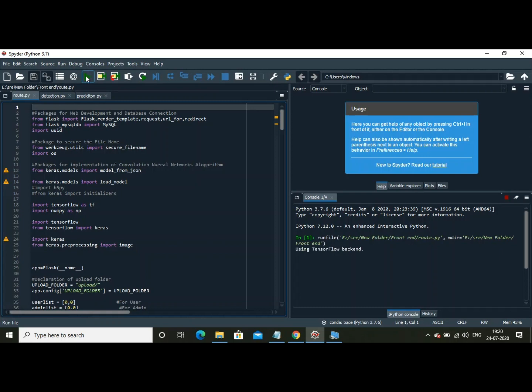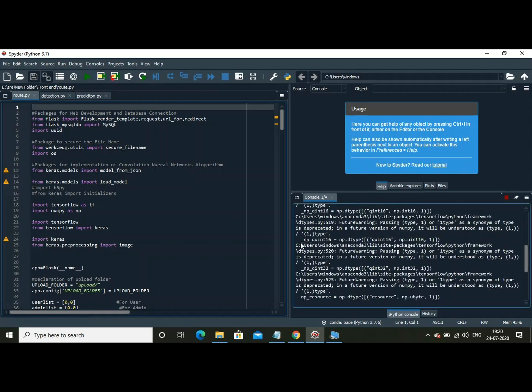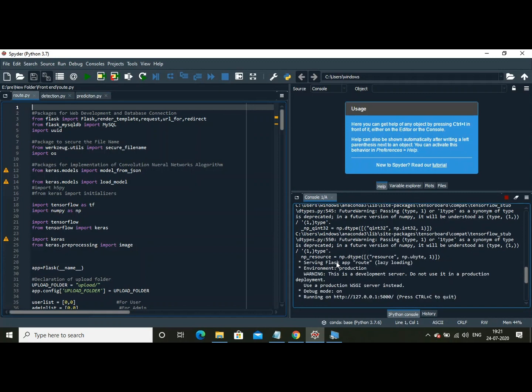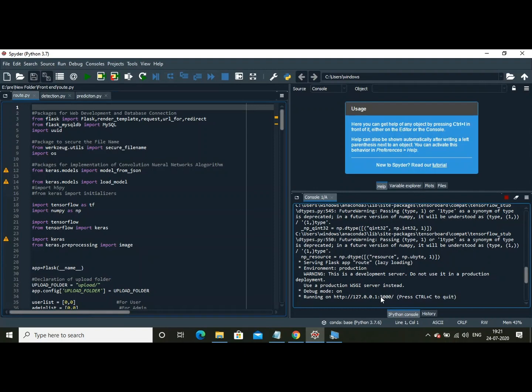By clicking on the run button, the whole application is being run. The server has been started. As you are able to see here, the server URL is localhost 5000. The 5000 is the port number.